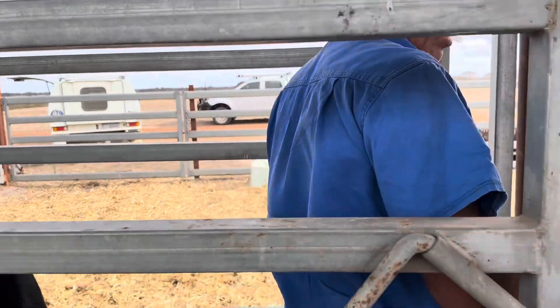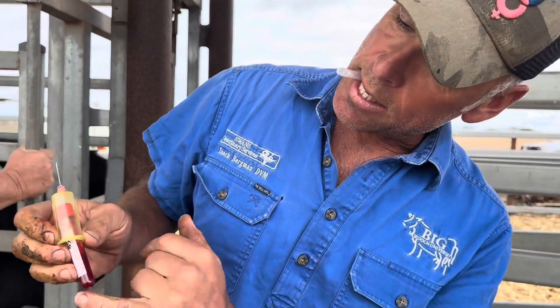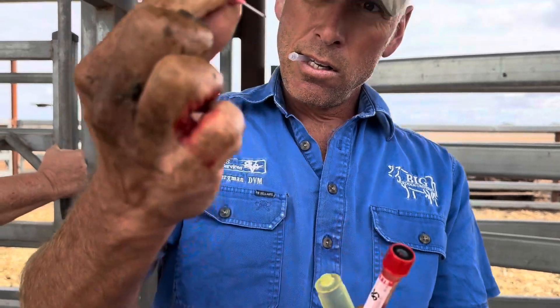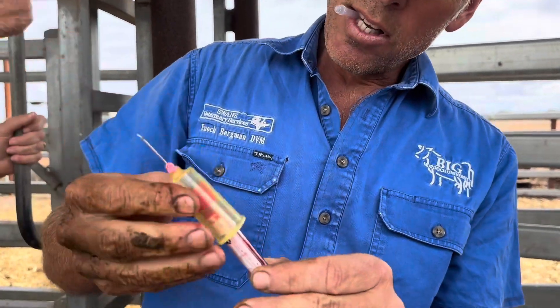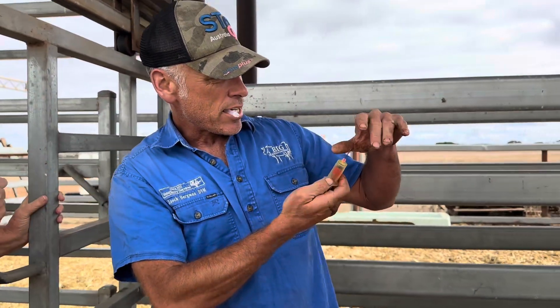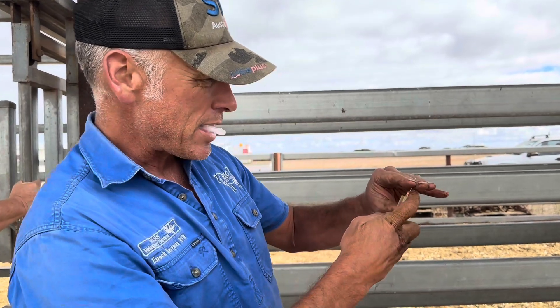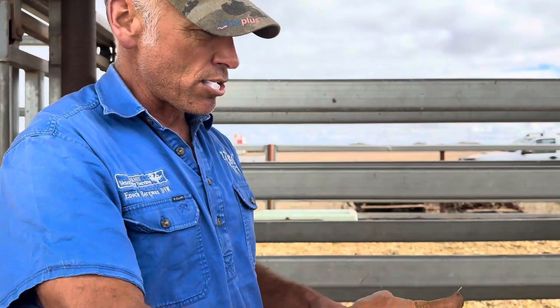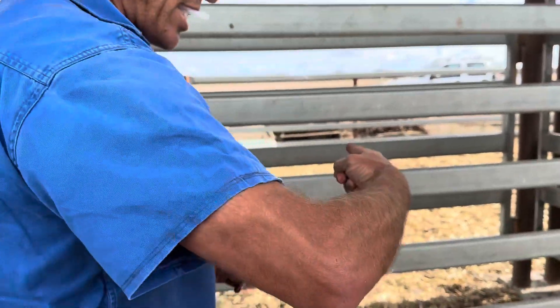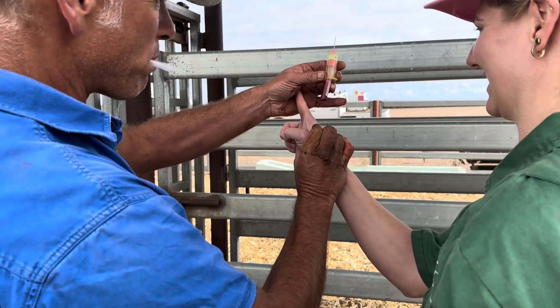So once you're in — this is a vacuum tube, guys. These things suck — it's got a vacuum in it. As soon as you pop that double-ended needle into the tube, it'll suck blood into it. But if the needle is stuck out of their tail, it'll suck air into the tube and then it won't suck anymore. So what you do is you pop through, and once you're in there, you can redirect until you get a flash of blood.